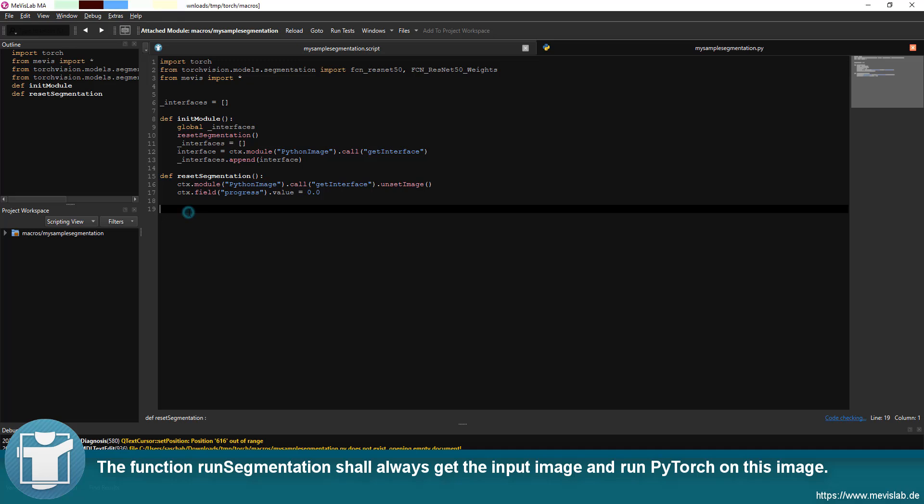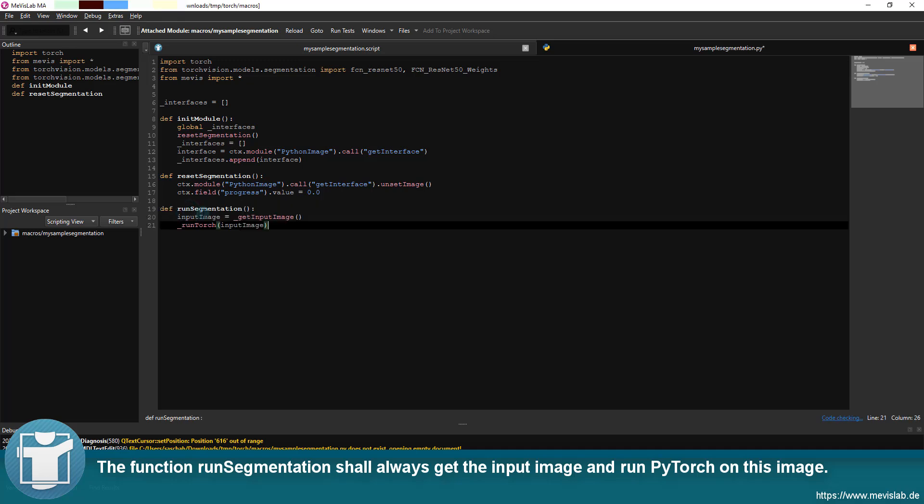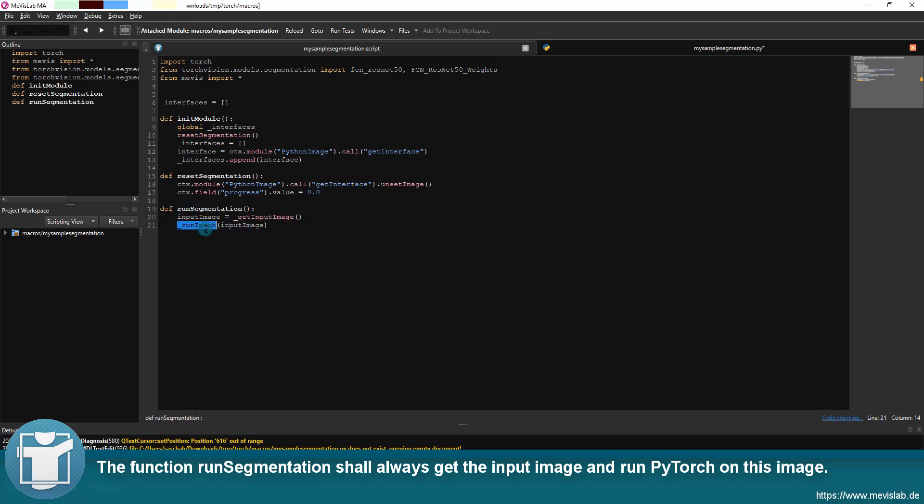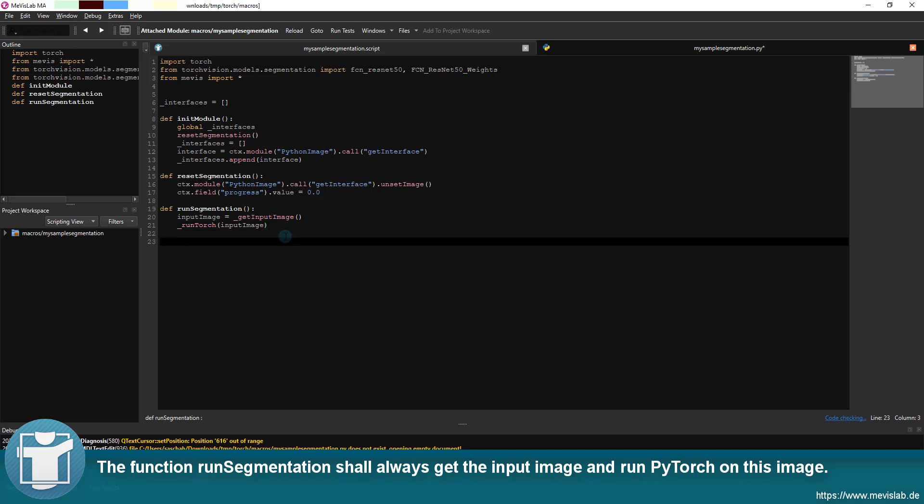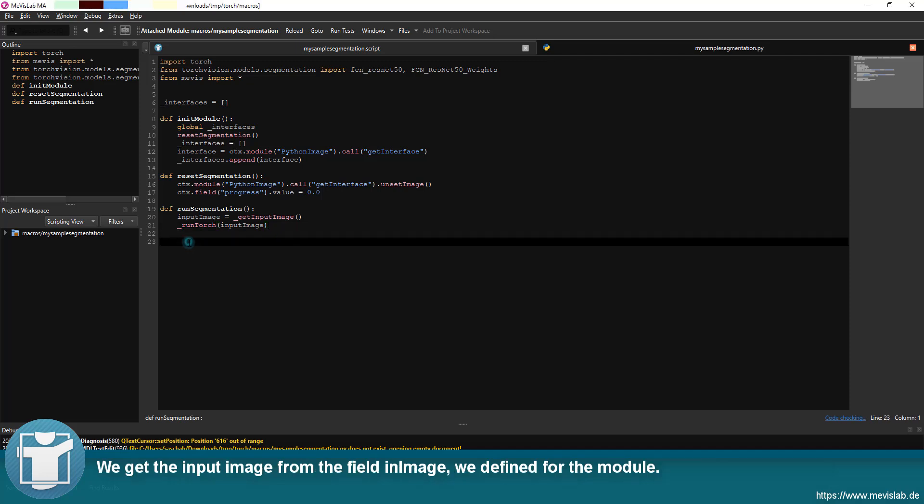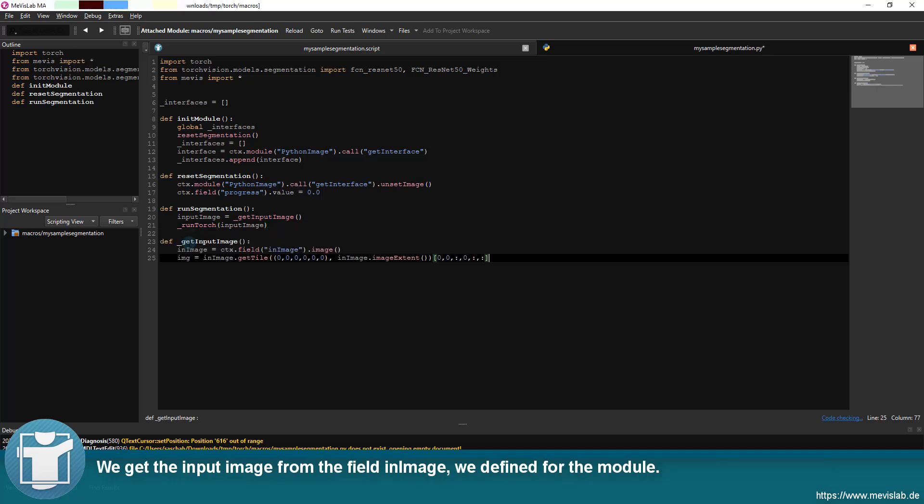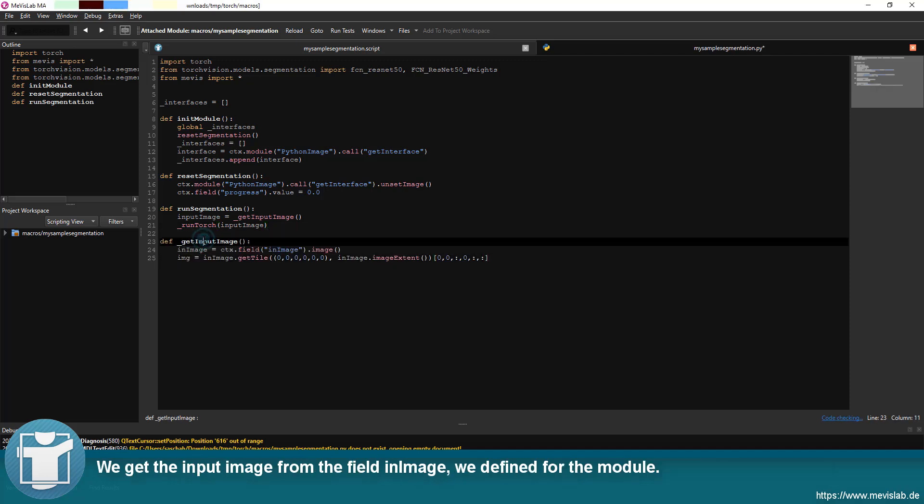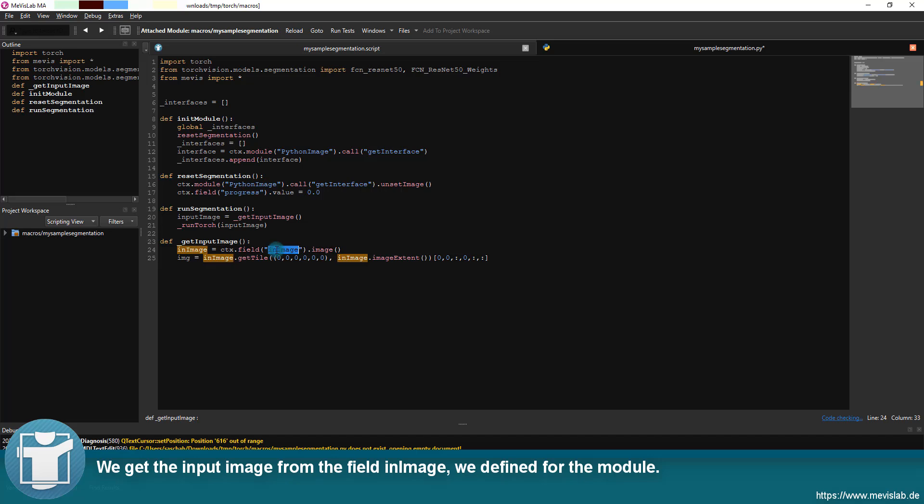The function run segmentation shall always get the input image and run PyTorch on this image. We get the input image from the field in image we define for the module.